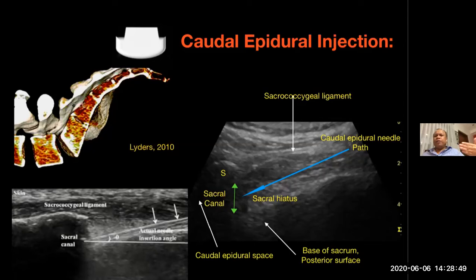So in other words, if you put the probe, you might not be able to actually see the entire needle in the beginning, because you have to move it a little posterior in order to estimate the amount of time that you can actually reach the area, until you see the needle tip going in, and make sure you go at just below your reference point, which is the sacrum. And then you can feel a certain give as you go in, and don't push yourself too much, because you might reach the nerve root level, which is really above that area.